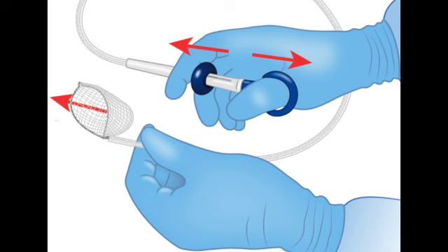And it leaves me, and hopefully you listening, with one last thing to chew on, sort of a reverse perspective. We've spent all this time talking about retrieving the samples. But just think for a second about the tools that do the initial cutting, like that cold snare. Imagine the engineering challenge there, designing those tiny instruments to cut precisely and to ensure the piece they remove is actually suitable for one of these retrieval methods we just discussed. The whole process starts way back with the design of the cutting tool itself. Something to think about.